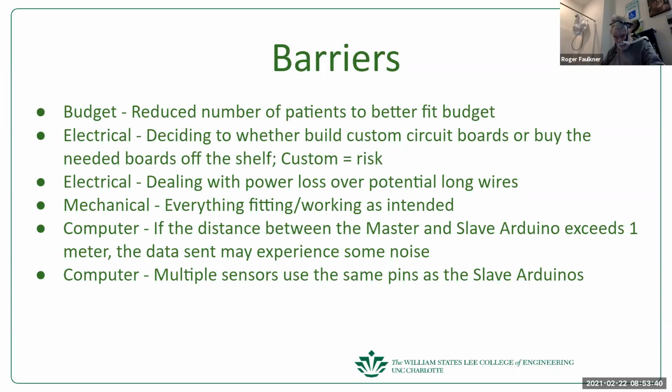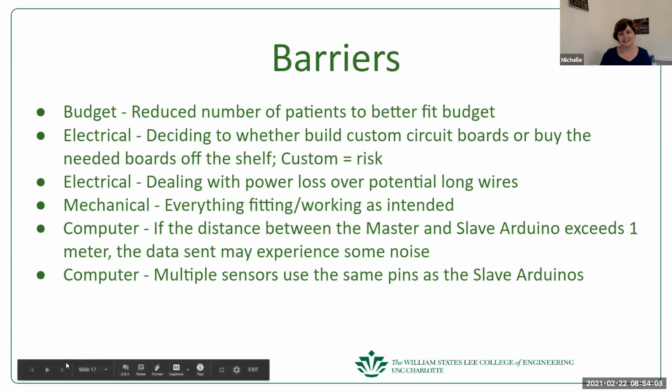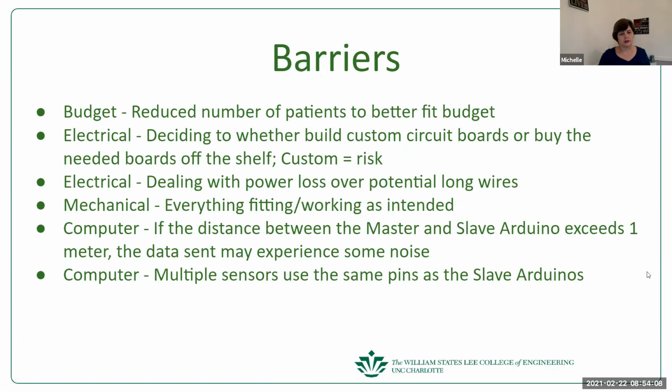Yeah. A question. Would coax cable fix the problem of signal interference? It wouldn't necessarily fix it, but it can reduce it. So do you have ways, in the lab there, I mean, we use oscilloscopes, but you can hook up LabVIEW with analog voltage just to look at what a signal looks like.